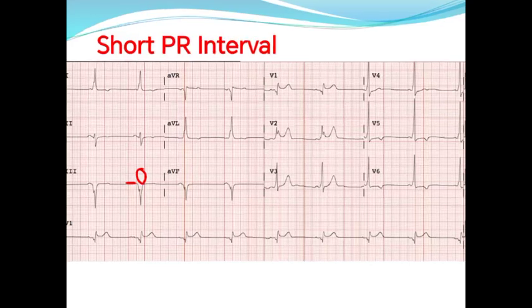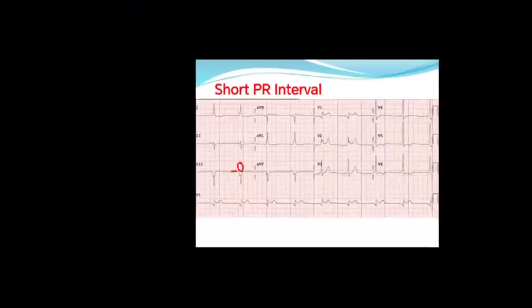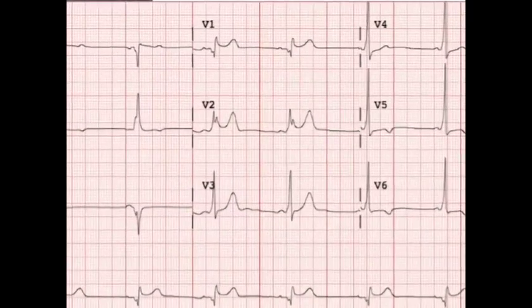Here is an example of a short PR interval. It's very short, less than the normal.